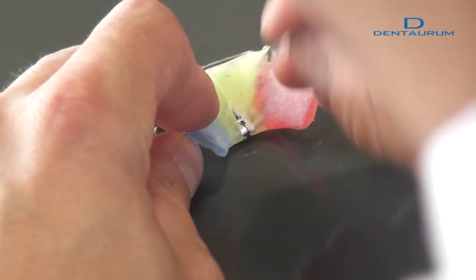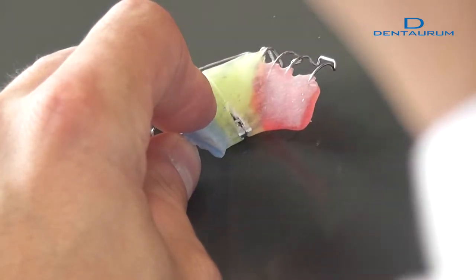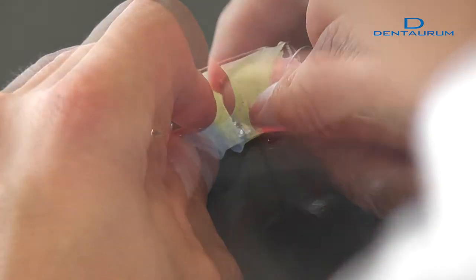Take care when checking the screw's functionality that the screw is turned back one way as often as it was turned the other way.